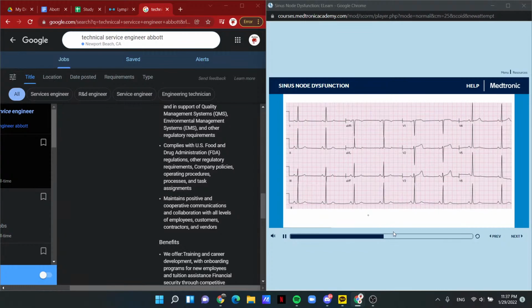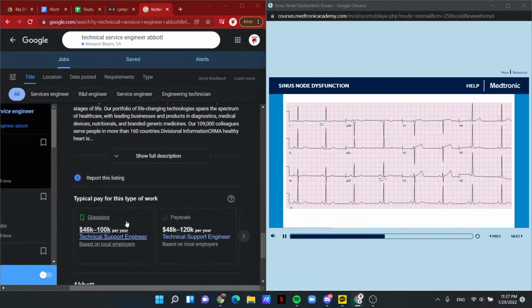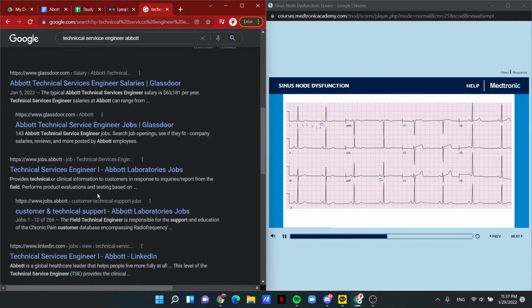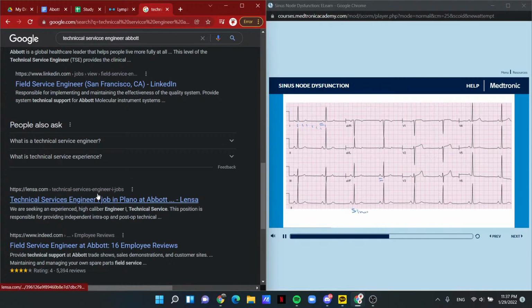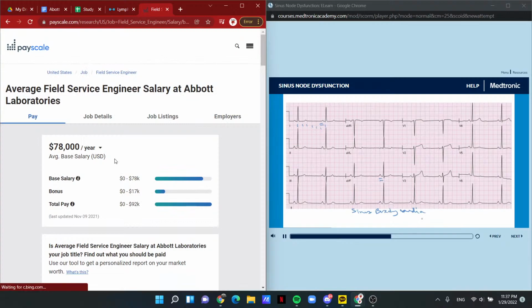This is an example of sinus bradycardia. There are normal P waves that are upright in 1 and AVF, but the rate is obviously very slow. We'll find a QRS that lands on a heavy line, and we can count off the heart rate: 300, 150, 100, 75, 60, 50. The heart rate is fairly stable, and we would consider this simply sinus bradycardia. In a healthy young person or someone who's well conditioned, this degree of sinus bradycardia is generally considered normal.